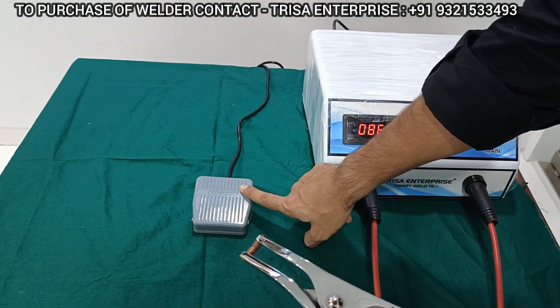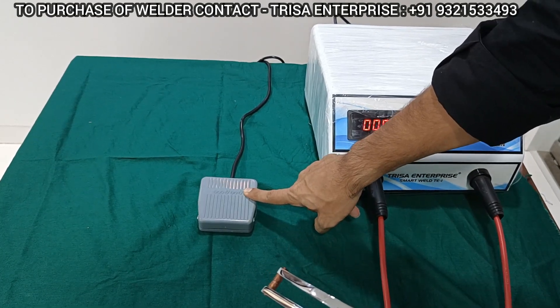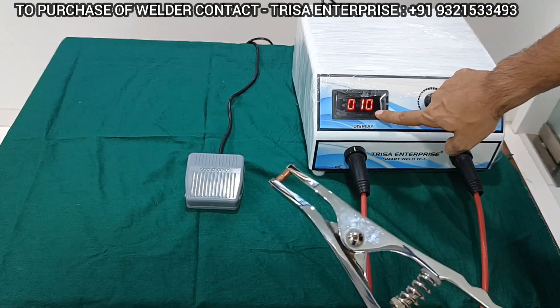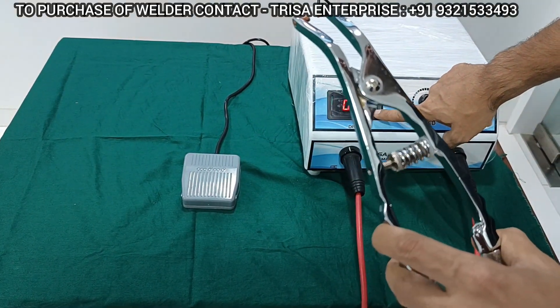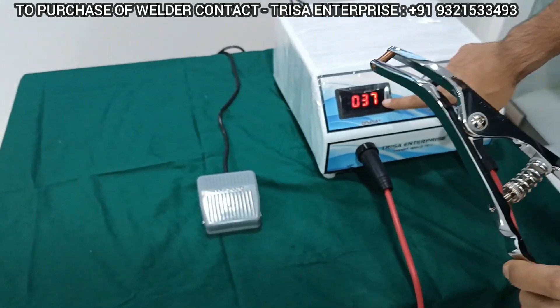So the moment you press the foot control, you see what is happening to the digital control over here — it goes to zero, and now automatically it has started to recharge. If you want, you can even open the pliers and close it back to make sure that the machine has got restarted.